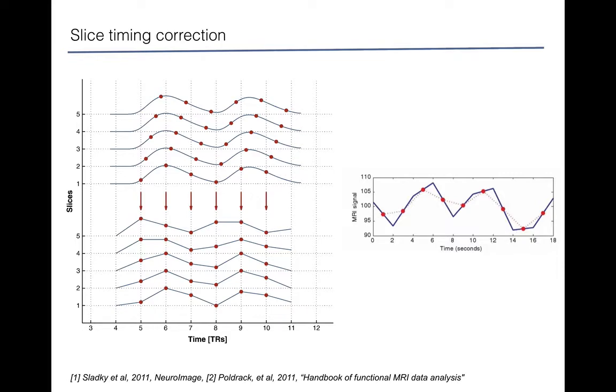Having said that, given that the bold response is slow, maybe this step may not be an issue in future at all, or many studies actually skip this step.